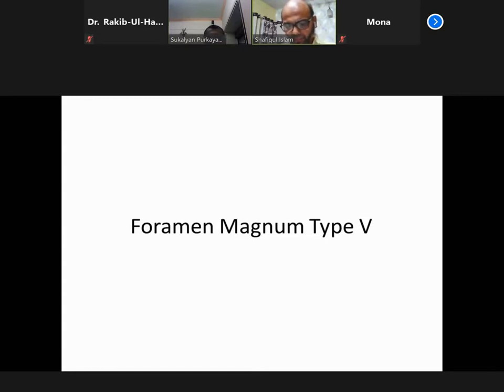And the next question, I think you already answered. In case we have to take the ascending pharyngeal, we have to go into the meningeal as distally as possible. As distally as possible. I have a question in that regard, and one of my residents also. Do you prefer a balloon microcatheter in this case? Yeah, yes. I will come into that.